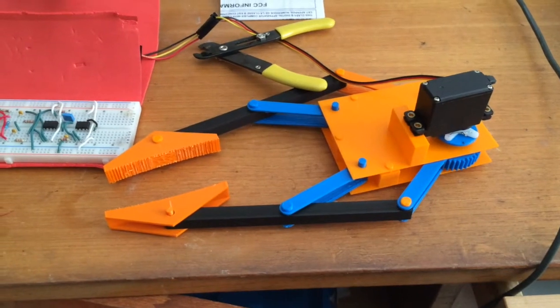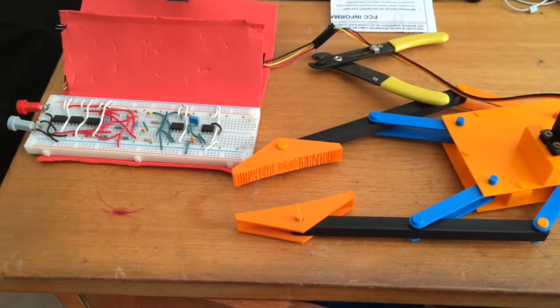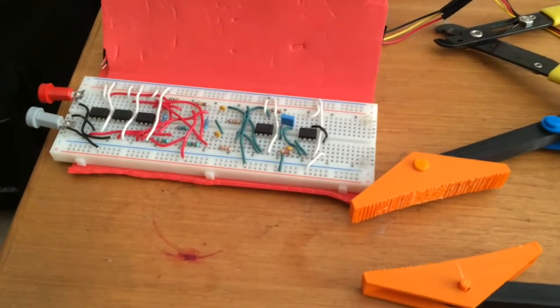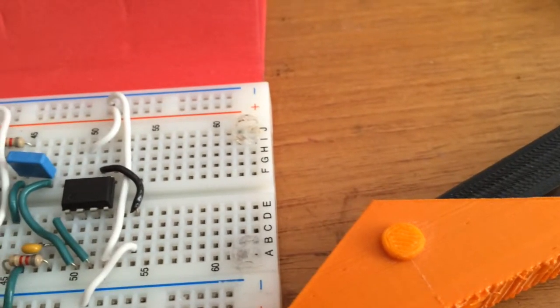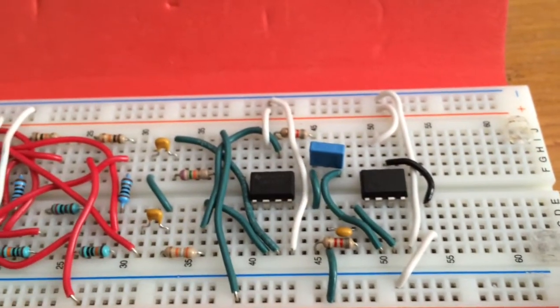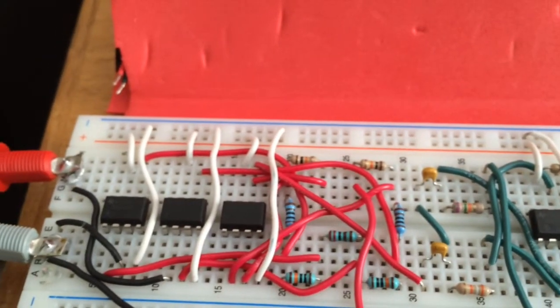We then took this amplified signal and fed it into a wide bandpass filter. The wide bandpass filter is composed of a high and low pass filter in such a way that it allowed us to pass signal only above 30 and below 140 Hz. Within the range of 30 to 140 Hz is the medically accepted signal range for forearm contractions. The rest is noise. We then took this filtered and amplified signal and fed it into our Arduino microcontroller for further processing and rectifying.